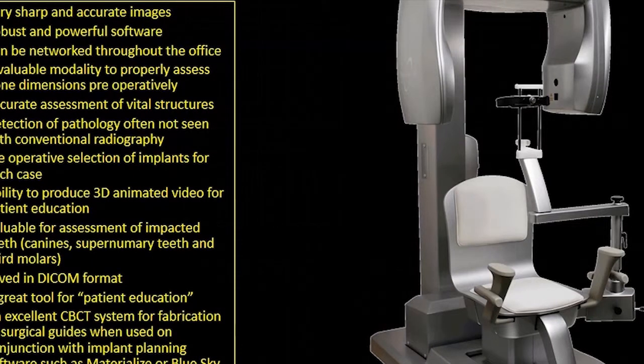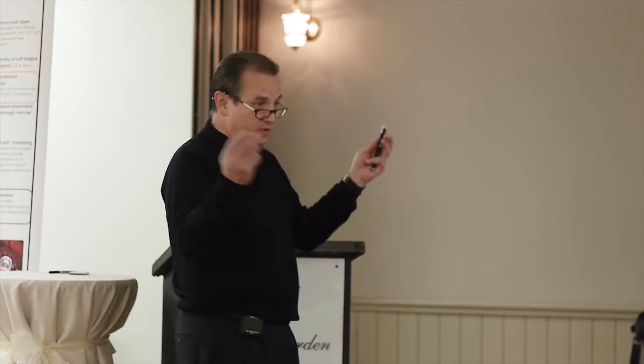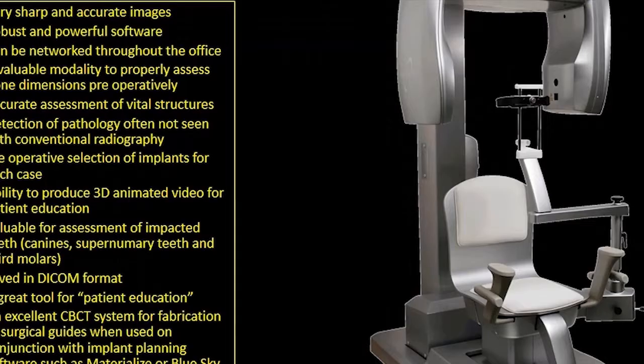We can produce a 3D animated video for patient education, which is pretty neat. And it's valuable for assessing impacted canine supernumerary teeth. It's saved in a DICOM format, so it's unlike, I guess, Sirona, where you have to have a Galileo, you have to have a Sirona. This is kind of open source? Yeah, open source. It's a great tool for patient education.